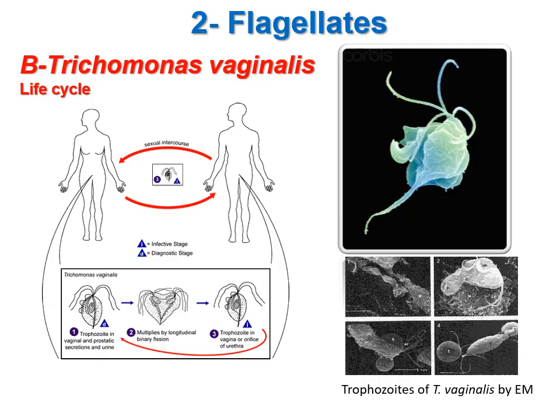It is very important to note that if we suspect this parasite, we should examine fresh preparations, because we only have the trophozoites, which cannot be maintained for a long while under normal oxygen pressure. So we should go fast to examine whether the trophozoite stages are there in, for example, vaginal discharge.